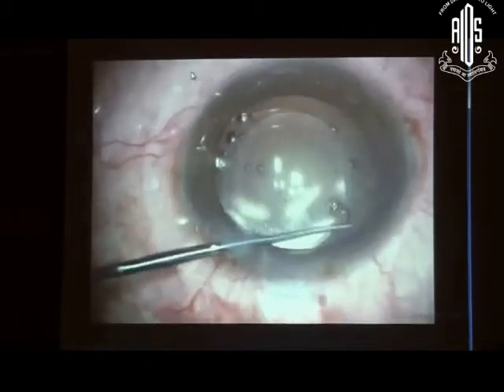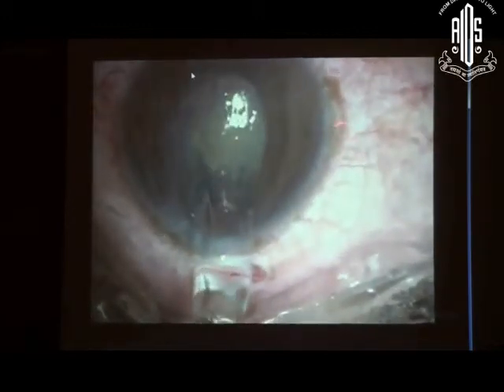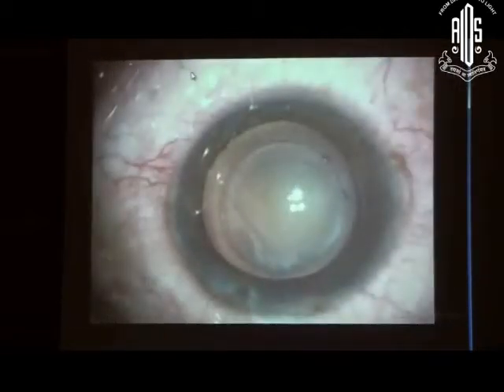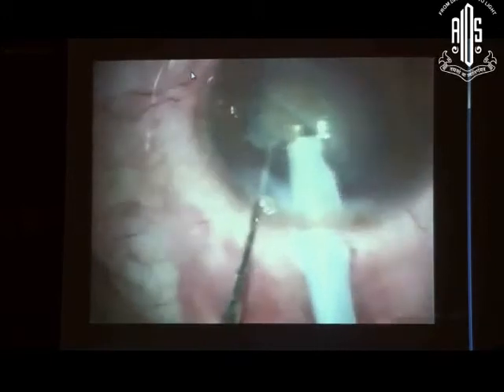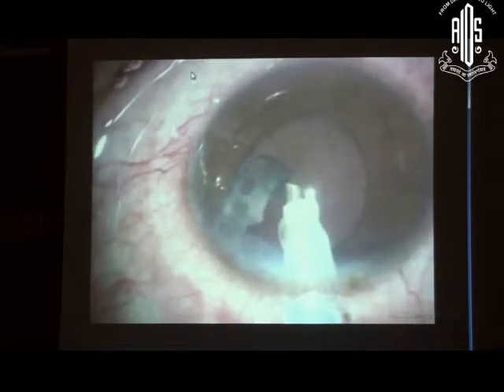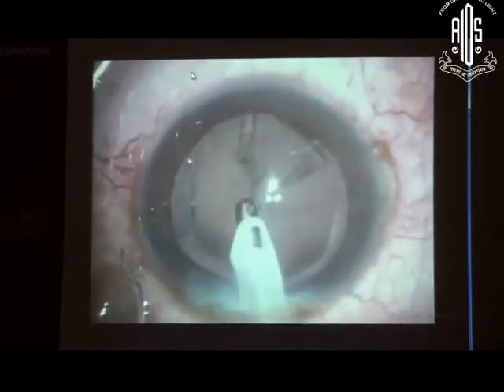Now I'm going to remove the ICL and then complete the rest of it. You can see the ICL can be removed the same way. Actually, when I put the ICL in, it was a temporal incision like anyone else, but here I chose to go through a scleral incision. I didn't want to go through the same incision. So here is the capsulotomy that was done with this machine, the femtosecond laser, and the rest of it is phaco. I sometimes think when I see this equipment, it's here to stay for some time.